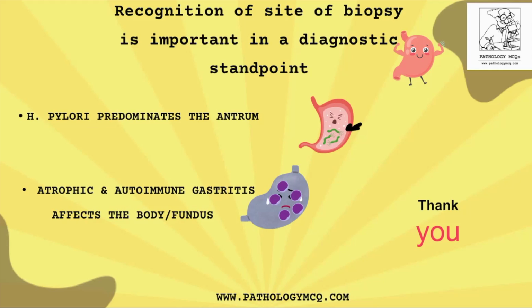Atrophic and autoimmune gastritis affects the body or the fundus, so you might get a biopsy which might resemble an antrum. So these are the reasons you have to know the normal histology of the stomach and the various differences in them.